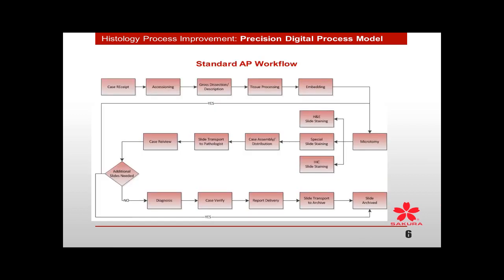This is just an example of a standard workflow, but the idea that I want you to get here is just a simplified standard AP workflow. Look at all the different steps. You have to make sure that all these different steps are worked to a small batch process, that they are completely standardized and efficient, because at each one of these steps there's an opportunity to amplify and sometimes prevent the proper delivery of both your glass slide and your digital data to the pathologist.